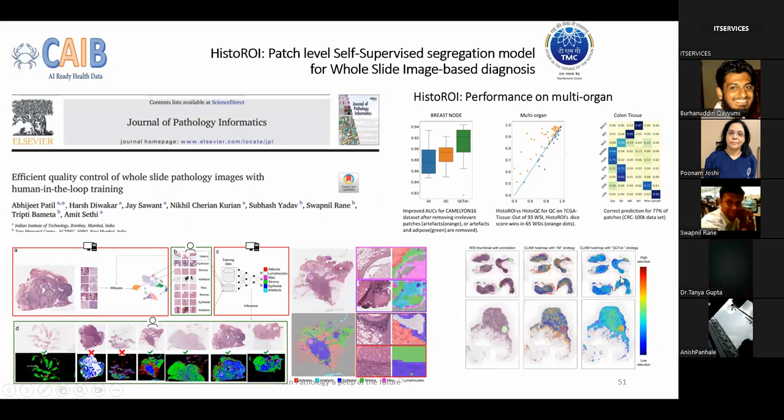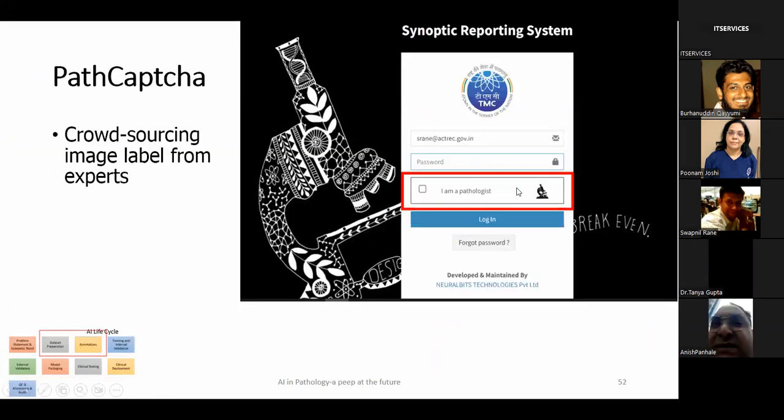So what it essentially allows us to do is that, as a byproduct, we can even detect tumor metastasis in lymph nodes, even small lymph node metastasis. It also improves the other algorithms by doing a lot of pre-processing and weeding out images that have a lot of artifacts and cause problems in analysis.